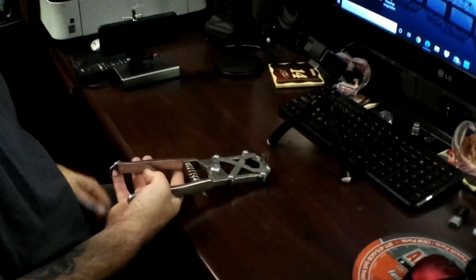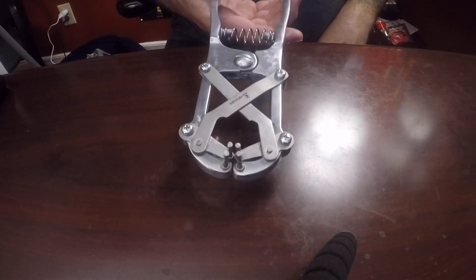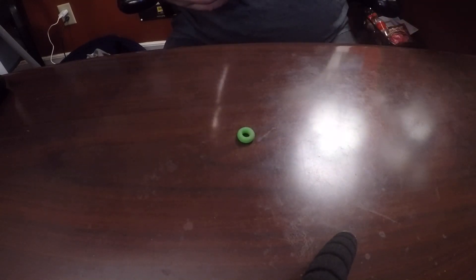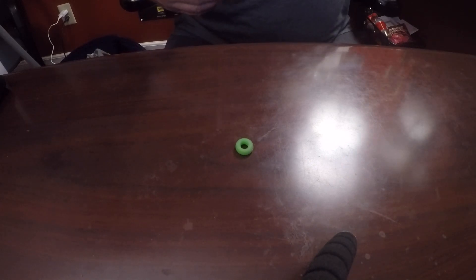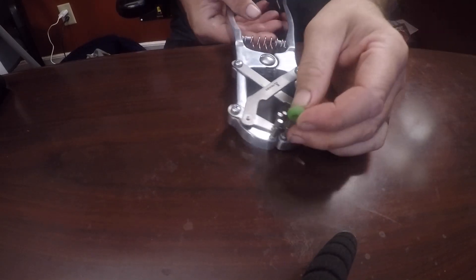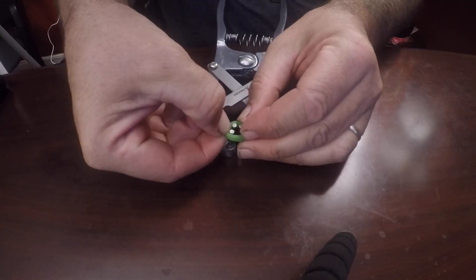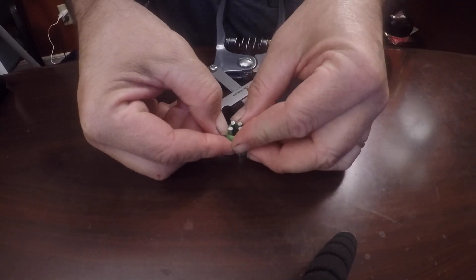This is the tool that applies the band. It's called an elastrator. What you do is put the band over the four prongs and then spread it. This is what the band looks like before it's stretched. They come in a bag of about a hundred or so. You grab it and slide it over the four prongs. There's a little lip on the four prongs — you want to make sure you get it down to the lip, because if you don't, when you go to stretch it open, the band's going to snap off.